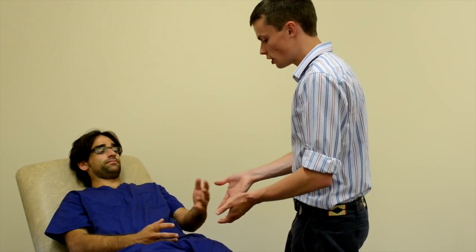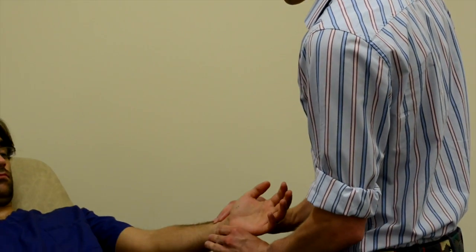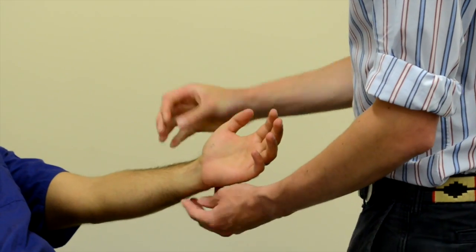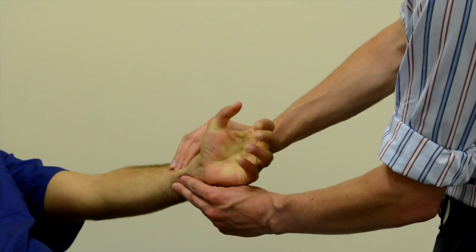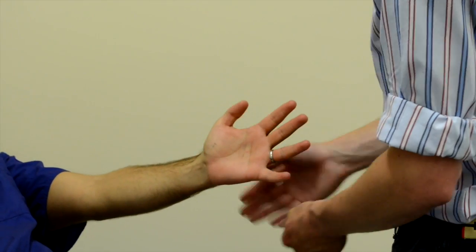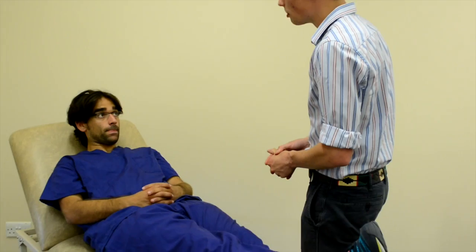So the first thing I need to do is just to check the blood supply to your hand. Could I have a look at your hand, please? So what I'll ask you to do is to make a tight fist and squeeze your hand as tight as you can now, please. Okay. Open your hand out. Thank you, Kishan. That blood supply is just fine. So I'm just going to set up my equipment now and I'll come straight back.